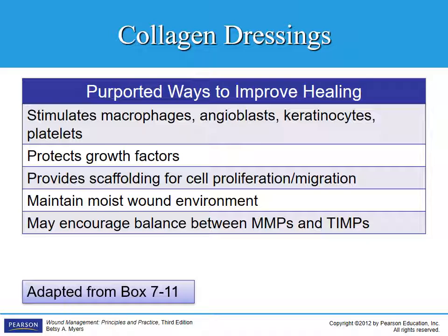It stimulates the macrophages, the angioblasts, keratinocytes, and the platelets, protects the growth factors, provides a scaffolding for the cell proliferation and migration. It maintains a moist wound environment and it may encourage the balance between the MMPs and the TIMPs. I'm taking you guys back to our very first chapter. So again, there has been some documentation of collagen dressings helping in some situations, just like the honey dressings. They're fairly new. They haven't been used for a long time, but they're having some really good success with them.